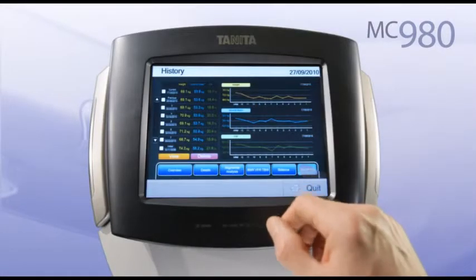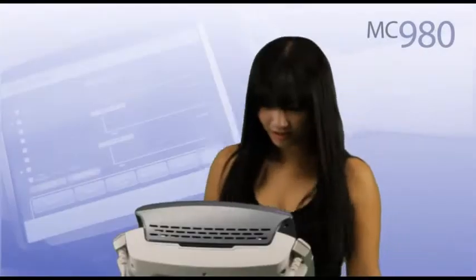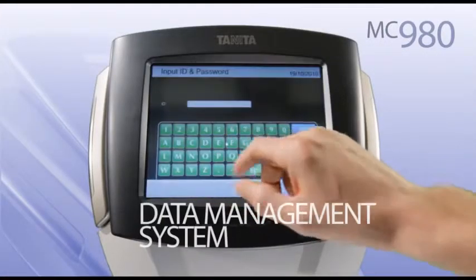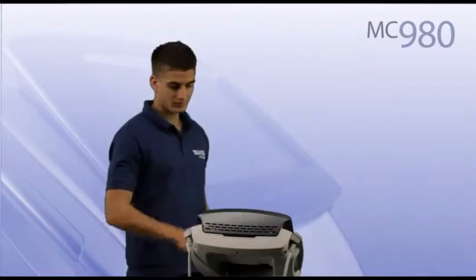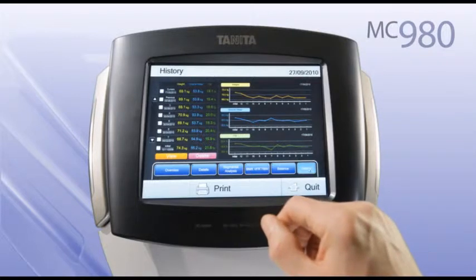The key to any effective health management, sports training or intervention program is a reliable workflow of progress tracking. The MC980 not only provides highly repeatable results, but also comes with a data management system. Measurement data can be directly stored and compared with personal targets. The history screen shows a simple to read graph to track progress.